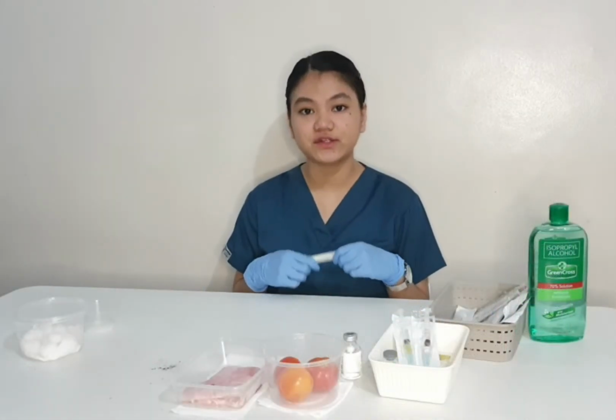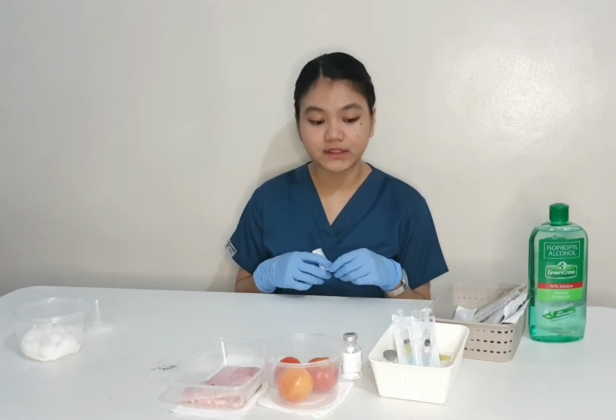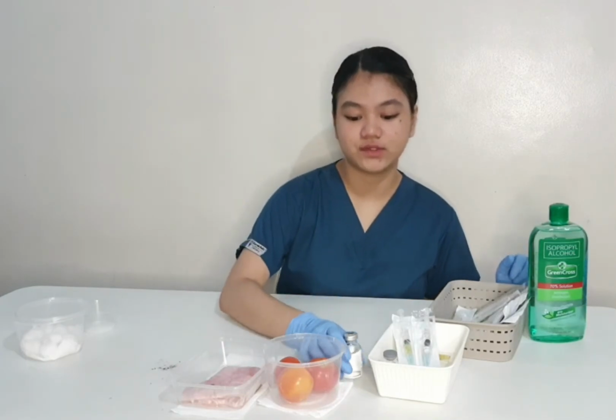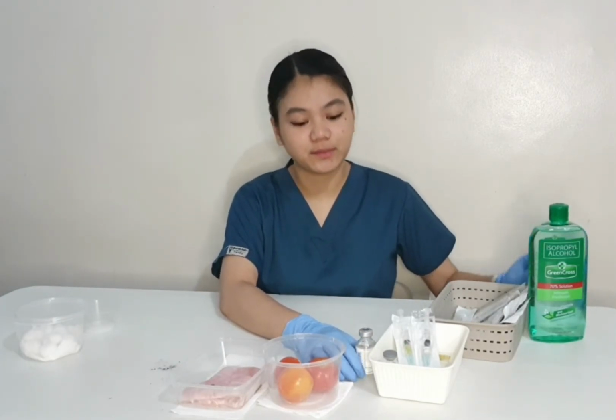Make sure to check the label and the name of the vial in the ampule when taking it from the cart, before administering and after administering, so that we can make sure that we are injecting the right medication to the patient.